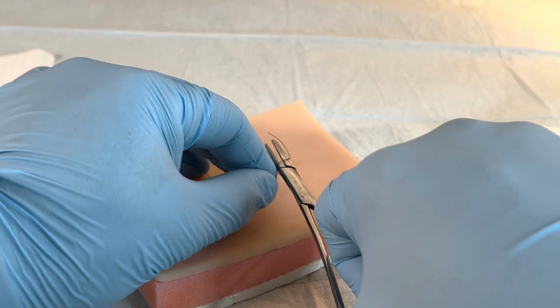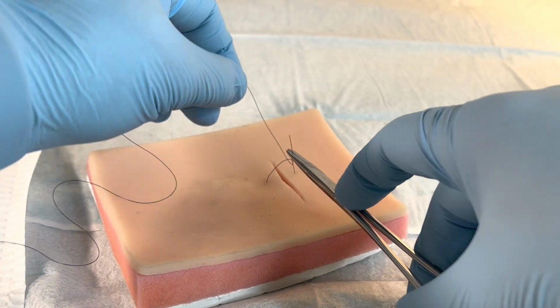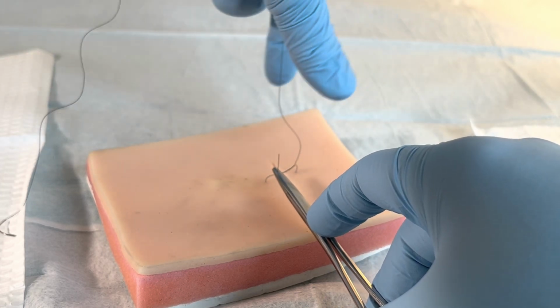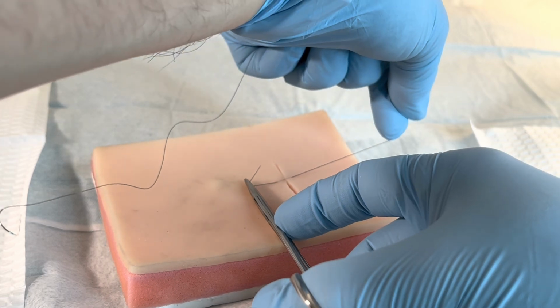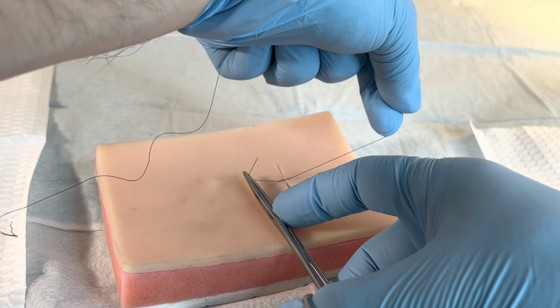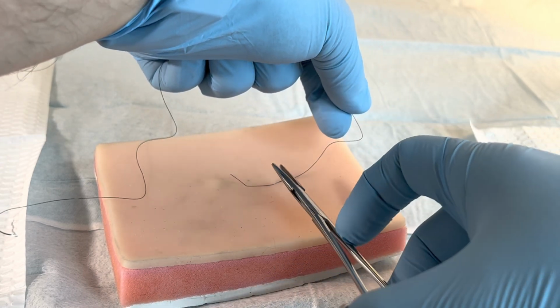I come back, I grab the tail, I pull through, and then my hands cross. So the lead end and the tail end go to opposite sides of the wound that they started on. And that surgeon's knot holds it tight. And then those are the steps. We just repeat them over and over again, 3 to 5 times.